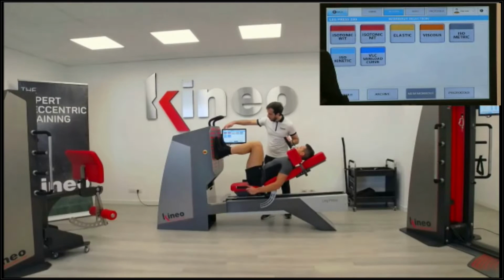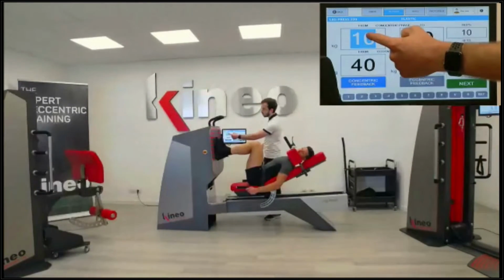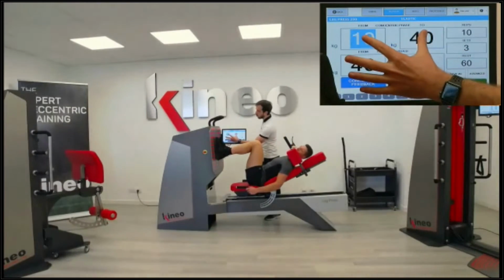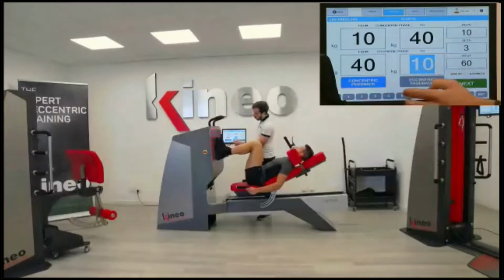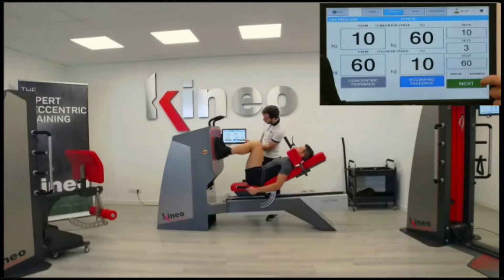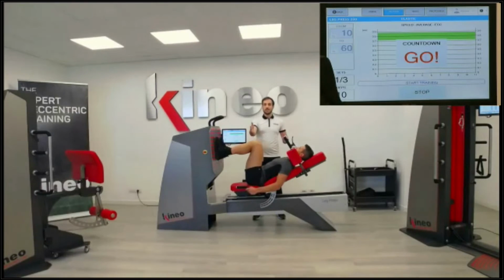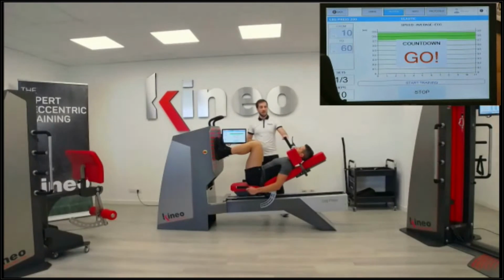Okay, so we go back to our training methods, we select elastic, and as you can see here, we go from the concentric first position to the eccentric end of the movement of the concentric. Those two loads are the first elastic, the concentric elastic, and those two are the eccentric elastic. Just to start, we select 60 kilograms. Of course, Damiano is a very strong runner, has very strong legs, so I'm not afraid to put some load on it. And we click next. Right now, Damiano is starting from this position at 10 kilograms, and as he moves, at the end of the movement there will be 60 kilograms in a linear elastic way. Imagine there is an elastic attached to our leg. Please go.